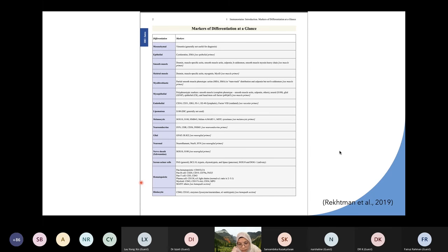And these are usually the sets of markers that we request. We cannot request them all at once. We have to request them accordingly, panel by panel. So that's why in difficult cases, we need extra days to report the case.